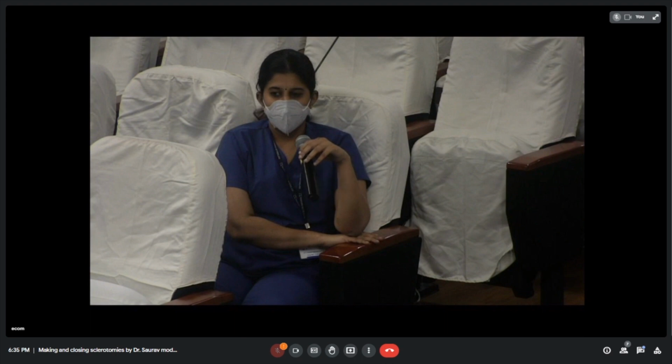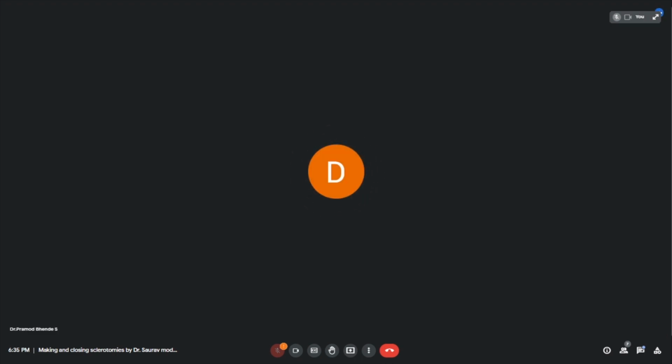Yes, Janani, one more point, just now what you said. Yes, sir. Just for the sake of everybody who feels we need to go for the self-sealing sclerotomy, it should not be too oblique. Otherwise, your entry and exit wound can be somewhere else, and sometimes you can remain in the suprachoroidal space also. So that enthusiasm of wanting to be oblique is one problem. Another problem is that if it is too oblique, the movement of the instrument also gets restricted in the eye.